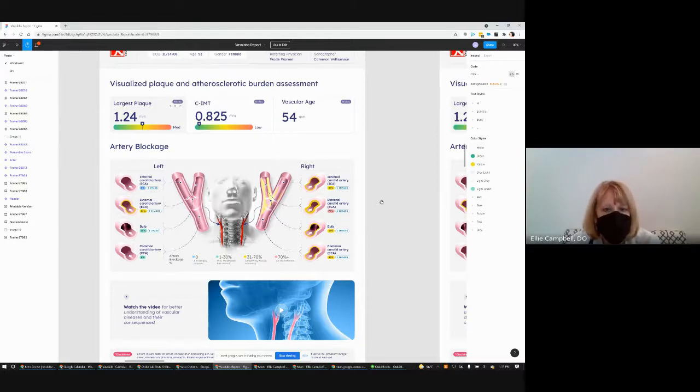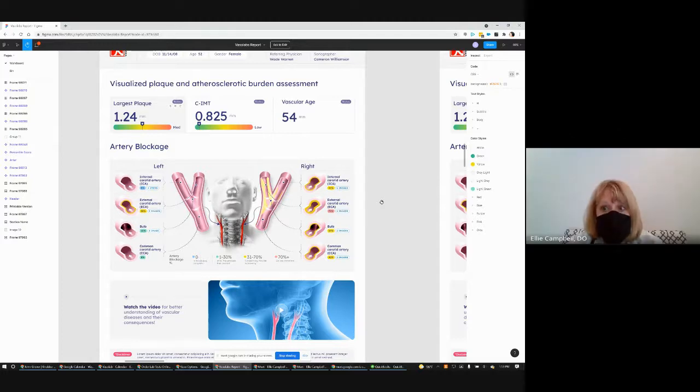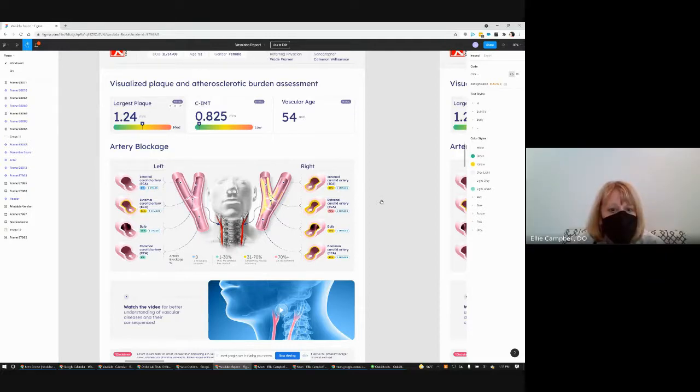The patients love the vascular age. That's the meaningful piece to the patient. So if I was going to design this report, I would have that pop out more than those other two readings. And you have a lot of serial scanning. I do a lot of serial scanning, so I need to show it to you in a way that shows the trend. Yes, please. Trend.